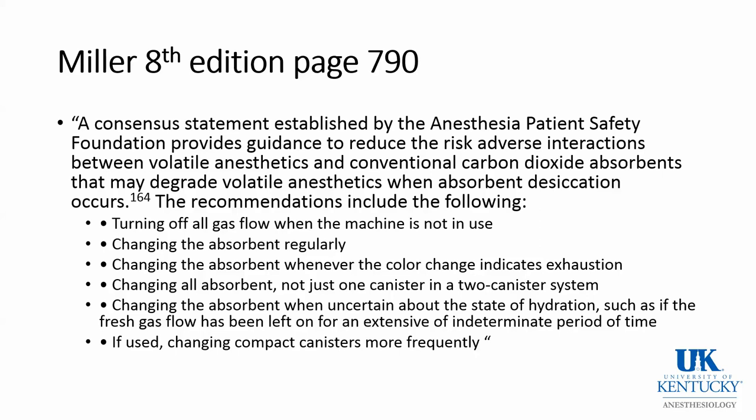If there is a 2-canister system, change all the absorbent. At any time when there's uncertainty about the state of hydration of the absorbent, go ahead and change it. And finally, if using compact canisters, they should be changed more frequently. Well, that only is logical.